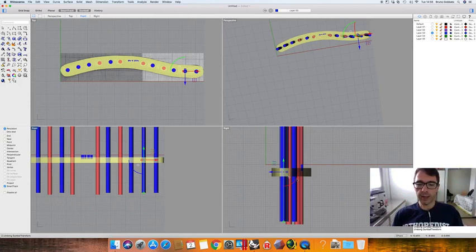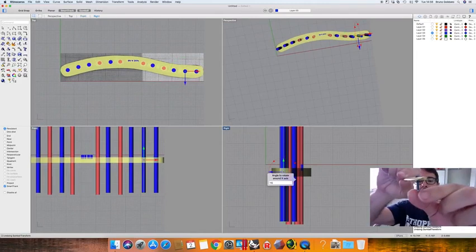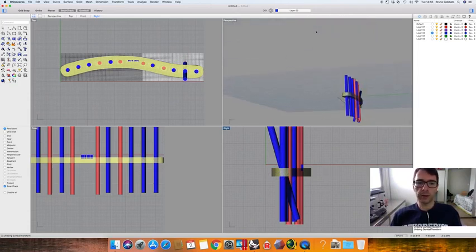We just click in this view, and we can change the inclination. Let's change for 15 degrees. For example, if we would have a 15-degree inclination anterior posterior, just click and we have here an inclination of 15 degrees. This is how we work with inclination of locked screws.